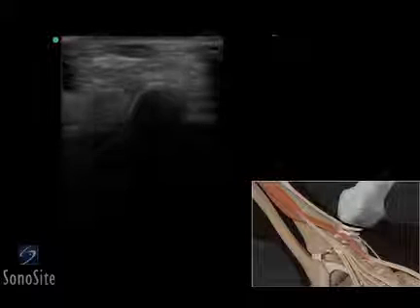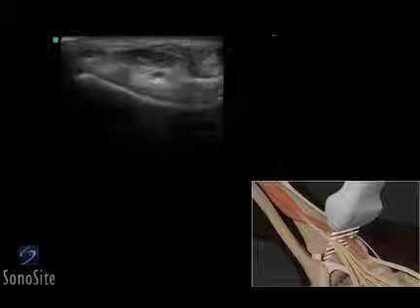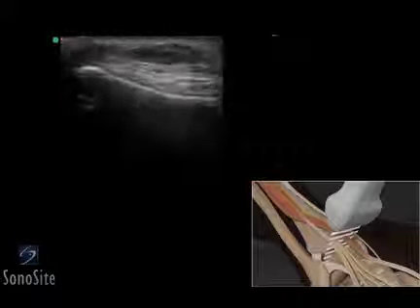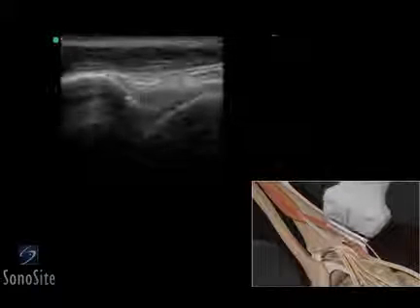The transducer is rotated 90 degrees counterclockwise and centered on the extensor hallucis longus tendon, just posterior to the anterior tibial tendon. This tendon should be scanned in both a transverse and longitudinal fashion.